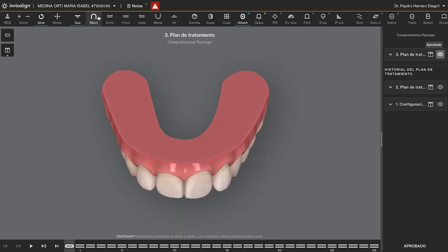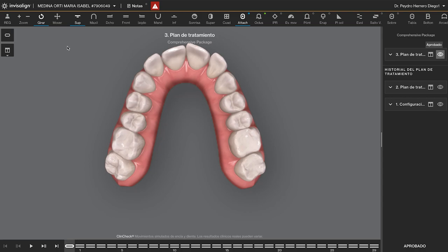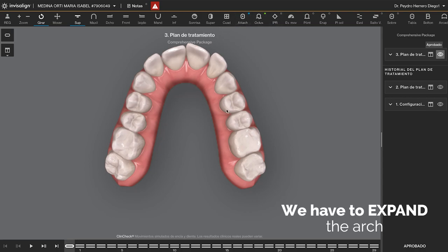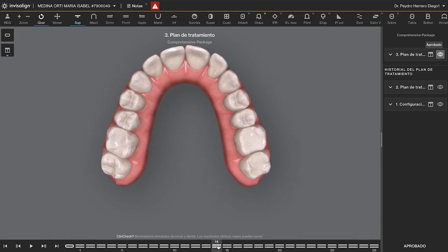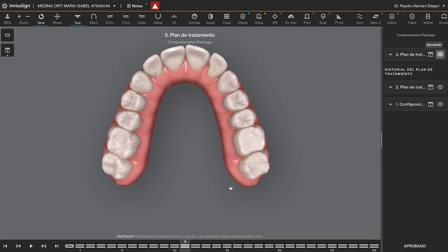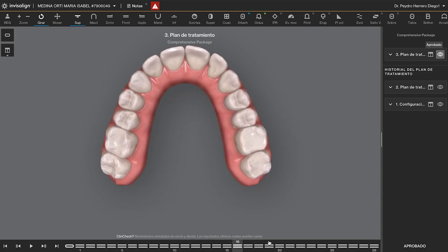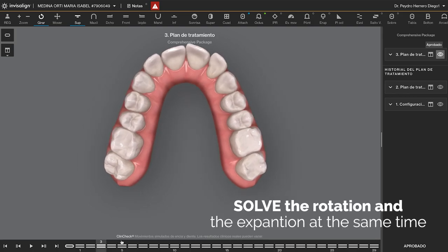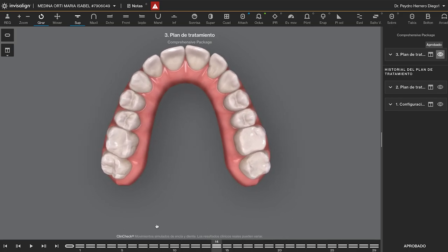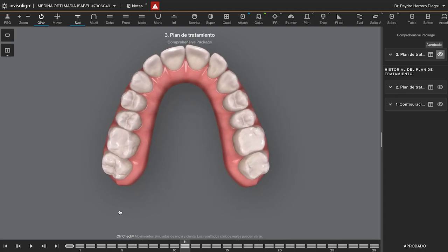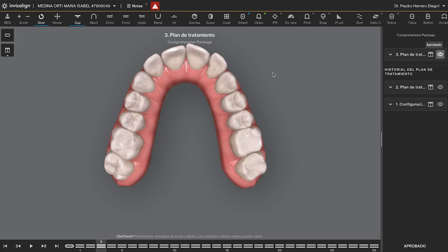The key point here is how to expand the arch. Let me show you first, and later I will show you the features and the attachments. As you can see, I'm expanding and rotating the molars mesially out at the same time, while also solving the rotation of the incisors and canines simultaneously. Remember, you have to solve the rotation at the same time as the expansion. I'm going to do more expansion on the left side because that's where I have the crossbite from the 7.